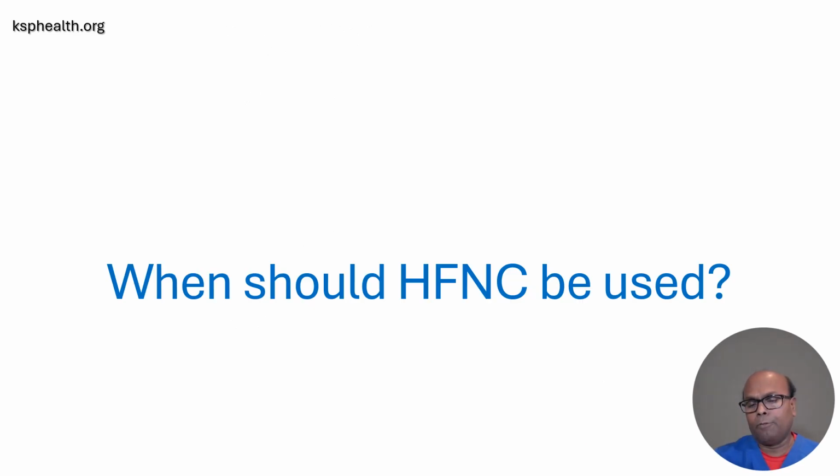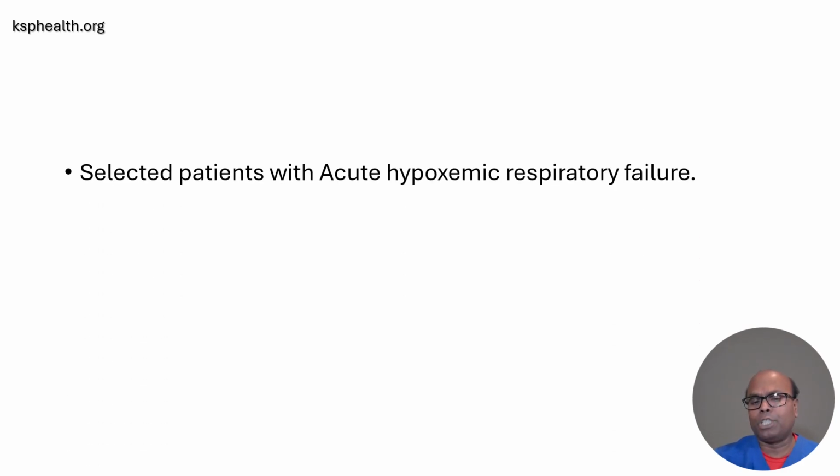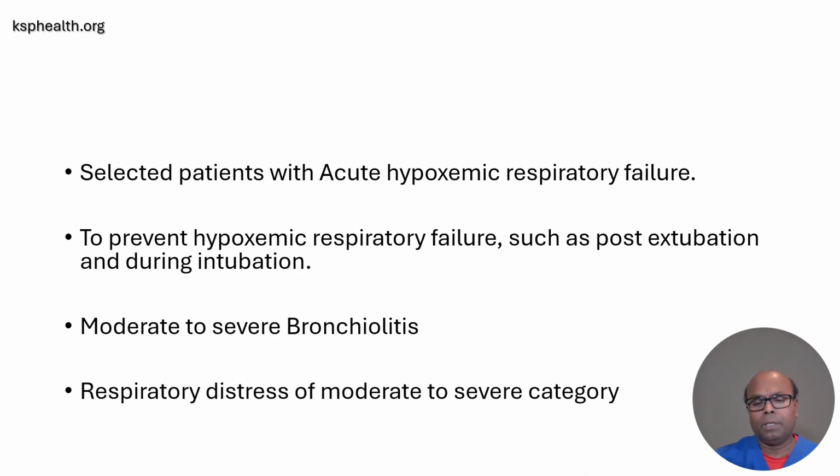When should high flow nasal cannula be used? Selected patients with acute hypoxemic respiratory failure. To prevent hypoxemic respiratory failure, such as post-extubation. In patients with moderate and severe bronchiolitis and respiratory distress of moderate to severe category. In all those situations, high flow nasal cannula can be used and it works well.